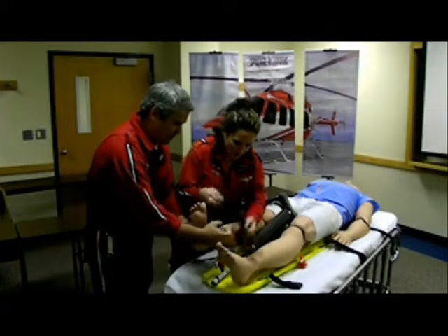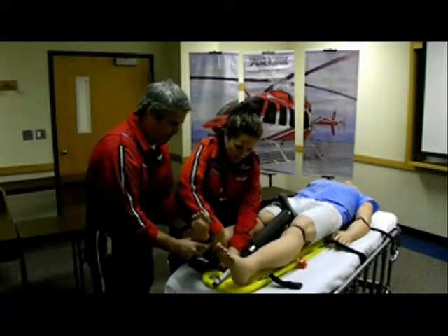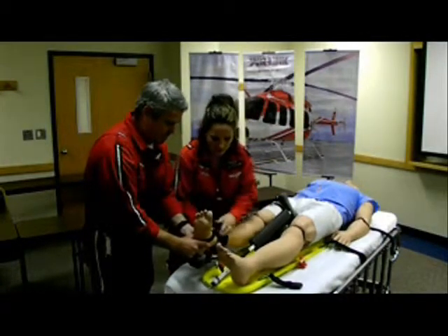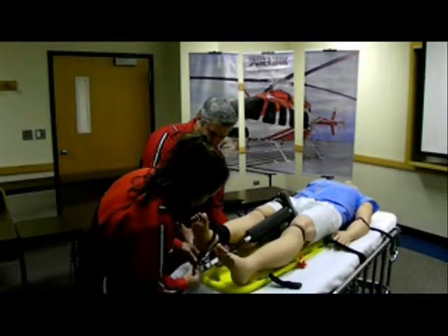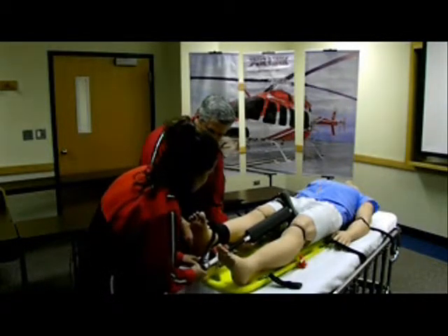Next, the ankle hitch is applied. The ankle hitch must fit snugly around the ankle. It's okay to place additional padding to make that ankle hitch fit tightly. Once your ankle hitch is on the ankle, you must then attach the ankle hitch to the Sager splint itself and apply the appropriate amount of traction.